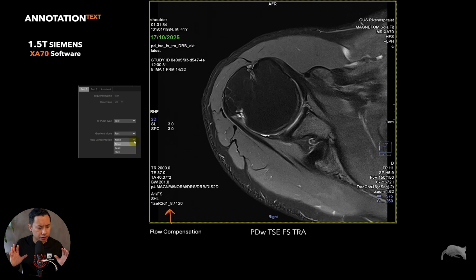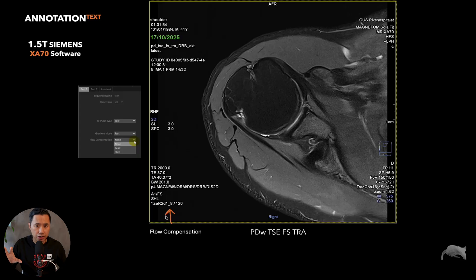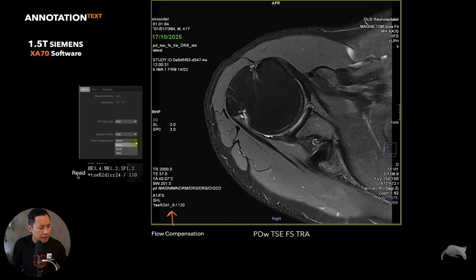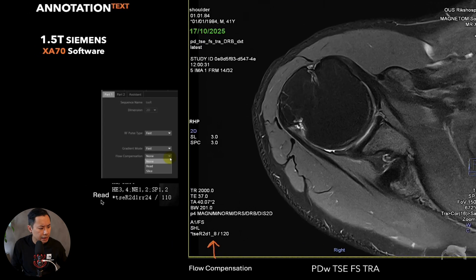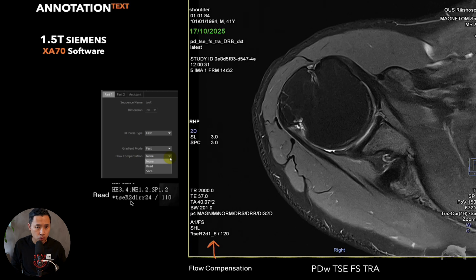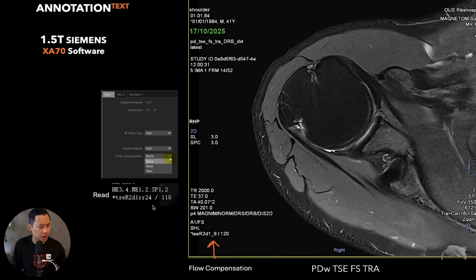As extra information, flow compensation is also shown. If you're not using any flow compensation it won't appear on the image, but if you're using it - either read or slice direction - it will give you a clue. For example, in this image in the lower corner we used read flow compensation, with the head coil, neck coil, and spine coil. You can see 'TSE restore on, 2D, R' - the first R means flow compensation is on and the second R means it is in the read direction - and the turbo factor is 24 with a flip angle of 110.